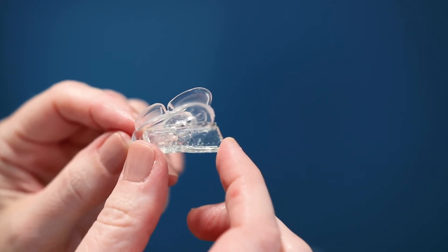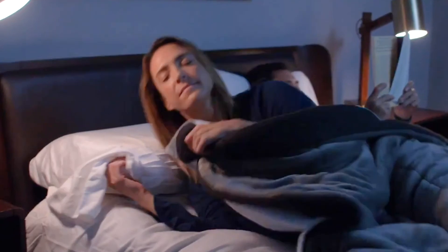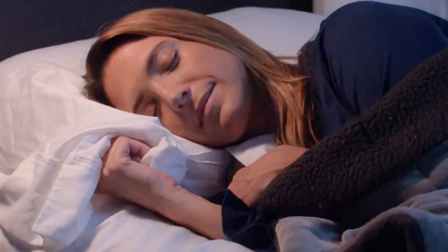For best results, begin wearing 30 minutes before lying down and concentrate on relaxing your jaw muscles.